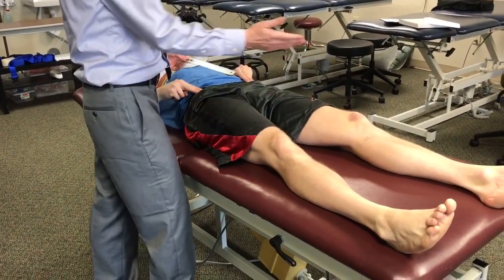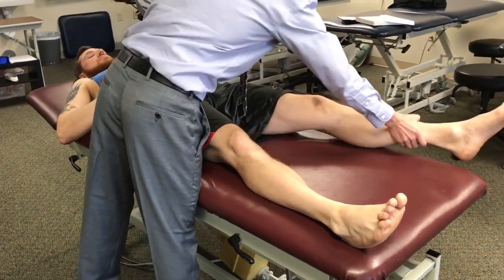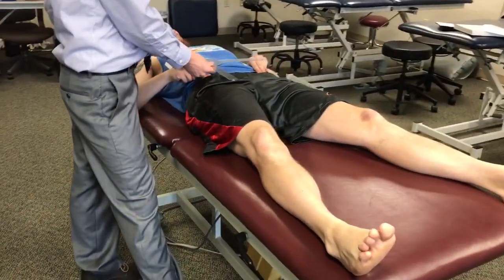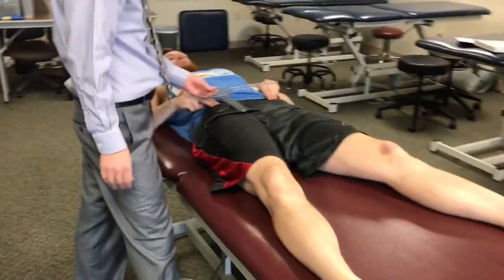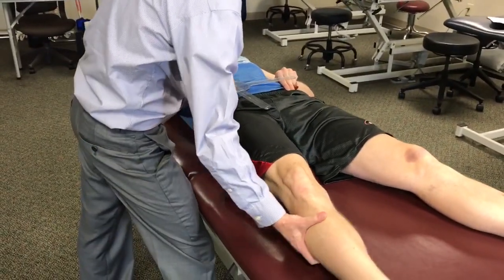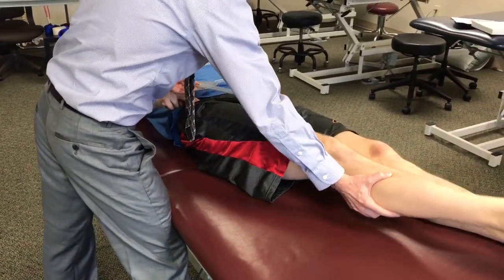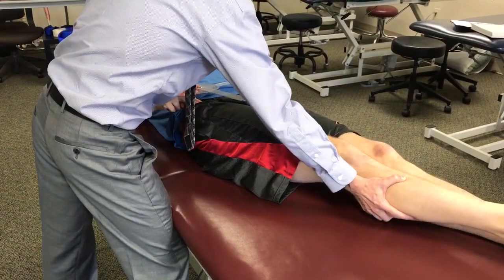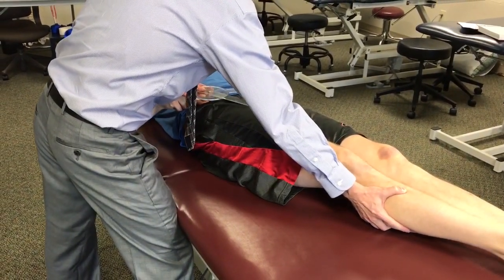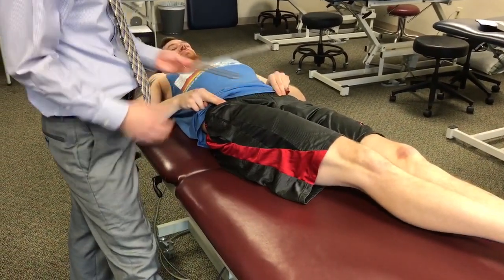For adduction we need to clear the other leg out of the way a bit, so we just put it towards the opposite side of the table. We use the same landmarks and adduct until we see movement of the pelvis, then take that measurement the same way.